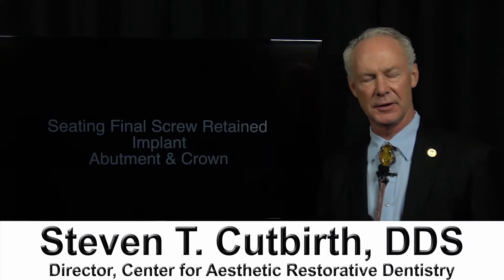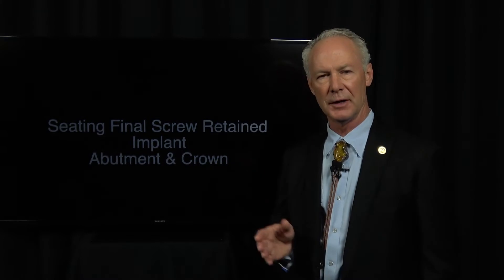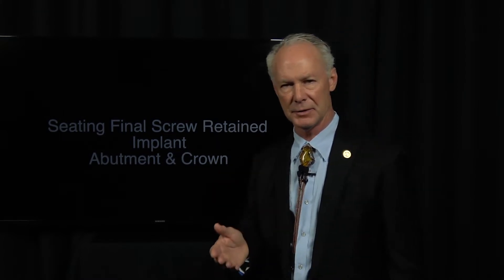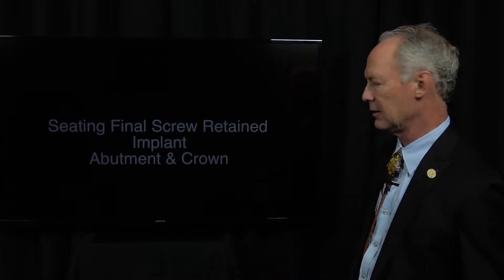Hello, this is the third episode of extracting a maxillary right cuspid tooth with the Easy Extract System — placement of an implant, bone grafting, and now we're on the third episode, which is seating the final screw-retained implant, abutment, and crown.